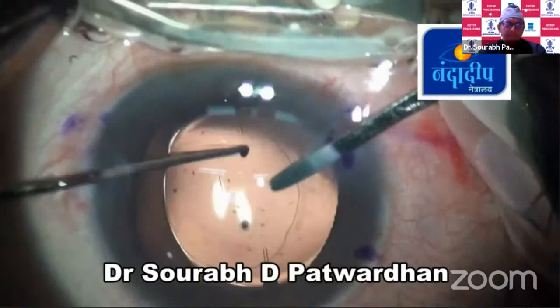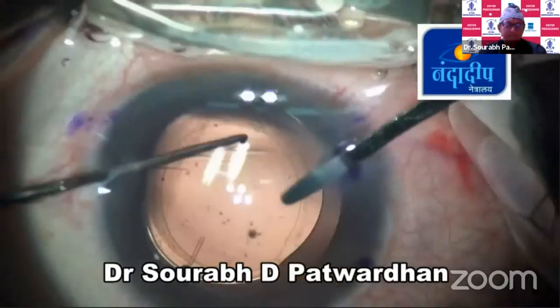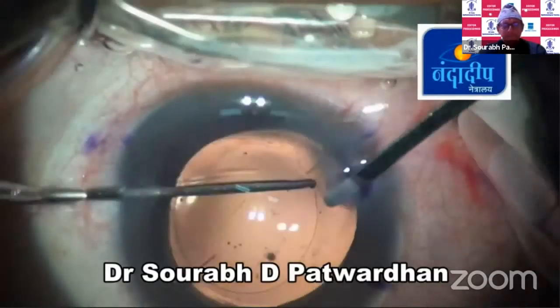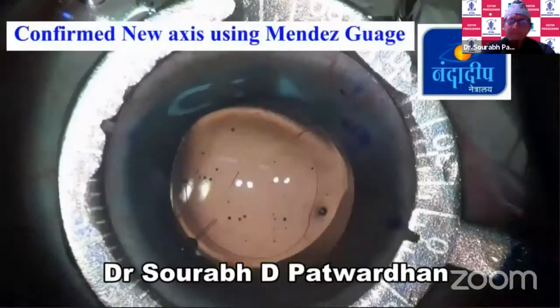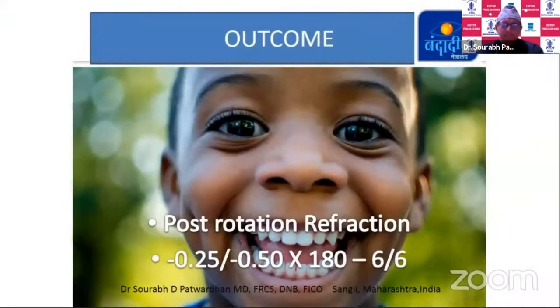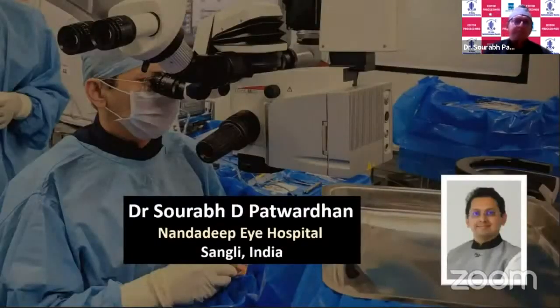And if you are doing it within 2 months, I think it is quite easy to do. Later there might be some fibrosis and you have to be careful. So once that is done, I am rotating the IOL slowly to its desired position. Once again confirming I don't want another procedure in this eye, and yeah, this is what I got. Very little refractive error and 6/6. The patient is very happy. So I think even if you get the worst kind of refractive surprises, you can tackle it very well.